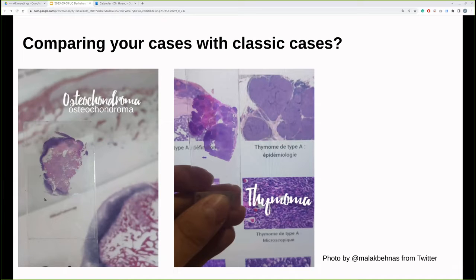So what can be a useful tool to assist pathologists? For example, a pathology search engine that compares your cases to other classic cases, because pathologists often compare the cases they are working on to previous examples, examples in the textbook, or ones they have gone over before. That's how they learn and become better at their job. The more cases they see, the more they learn. So could we use a similar method to help pathologists learn, or simply assist them in retrieving similar cases to enhance their diagnosis? It could help them quickly pick up something, especially junior pathologists, trainees, or even medical students.